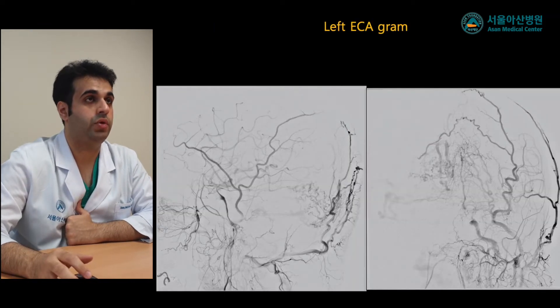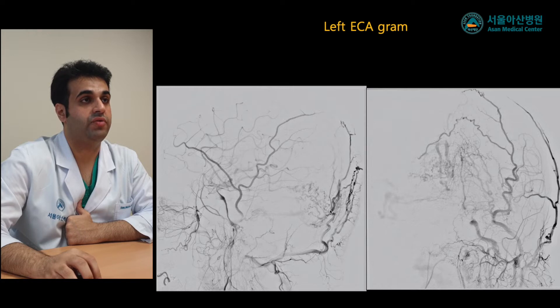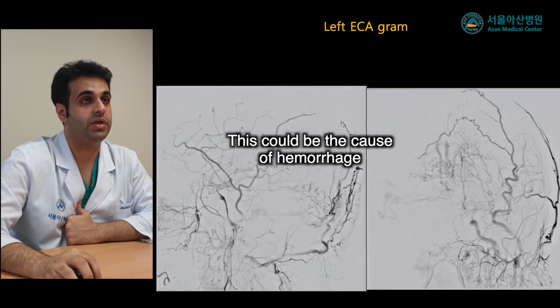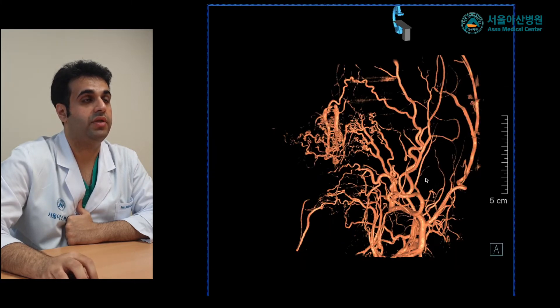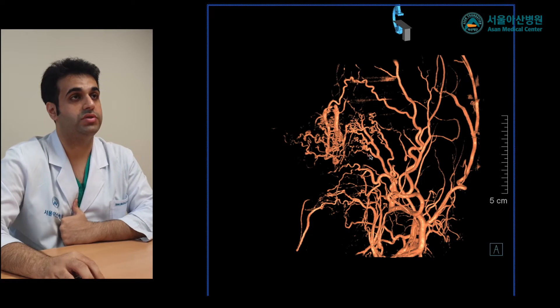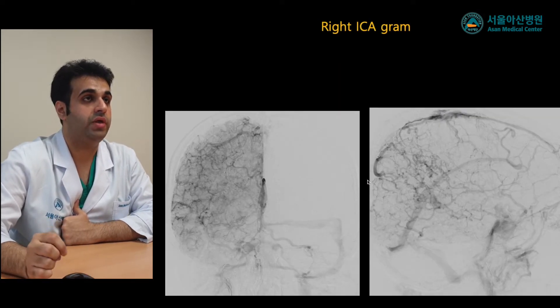After that, we injected the left external carotid artery, which demonstrates a feeder from the transosseous branch of the left occipital artery draining to the torcular region and the posterior superior sagittal sinus. The transosseous branch feeder is actually bilateral, but more prominent on the left side, as demonstrated on the 3D reconstruction image.